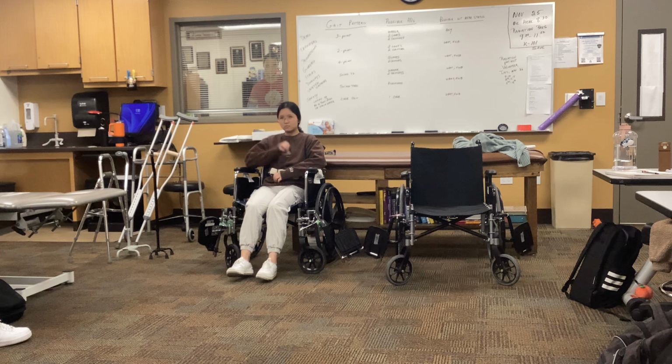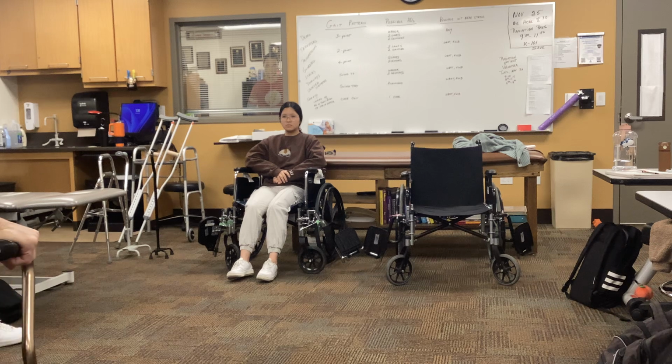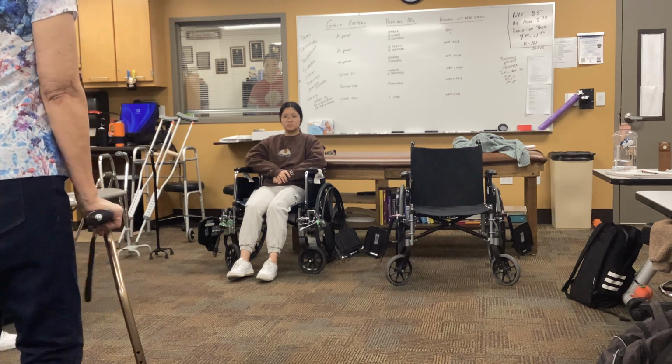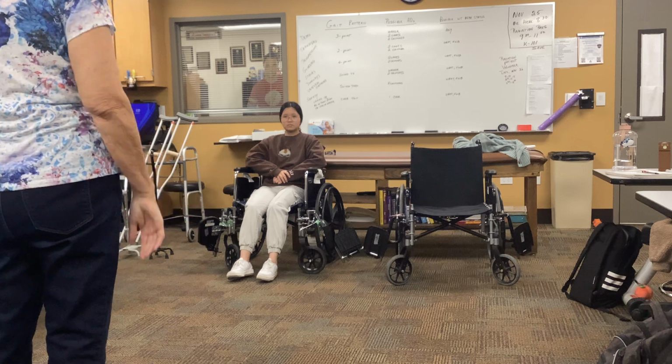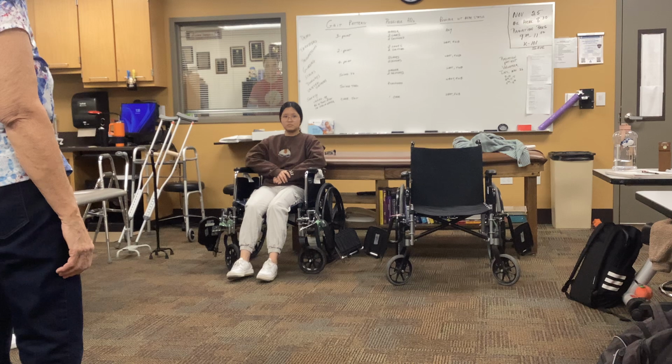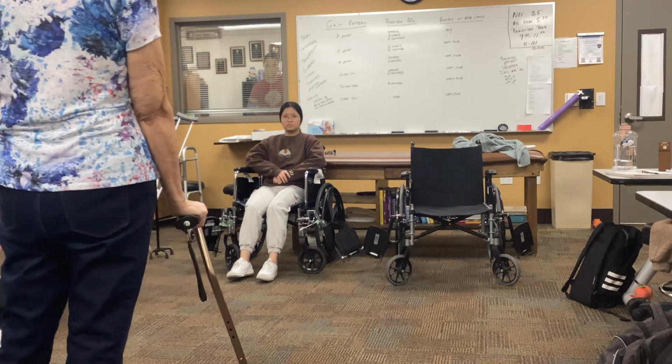So let's take a look at it, and you tell me why it goes on the good side. What do you think, Mahira? For better balance or equilibrium? But why? Why not this side for better balance? Ryan? You need to put all your weight on the good side.